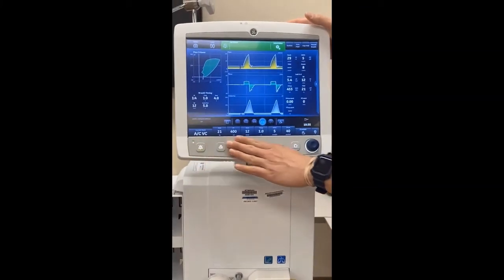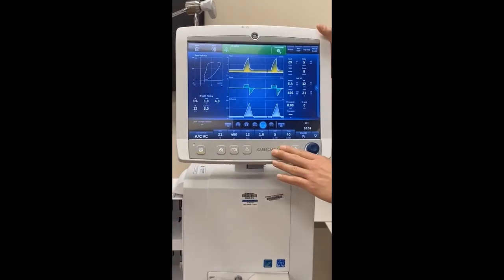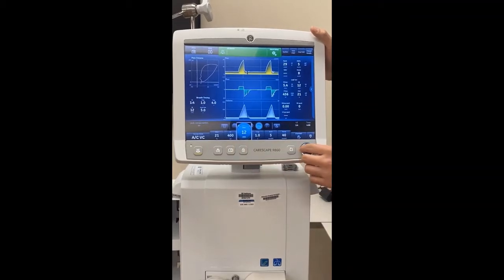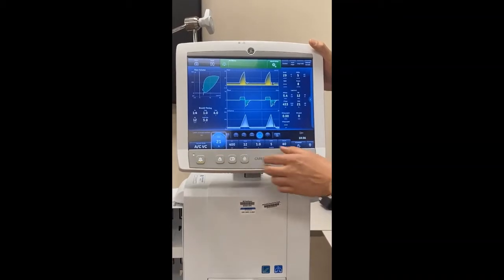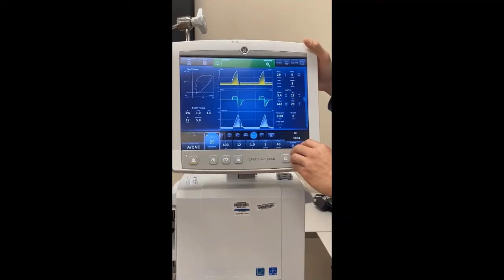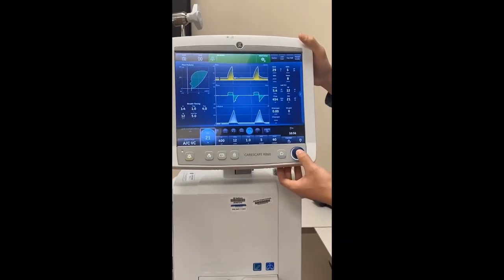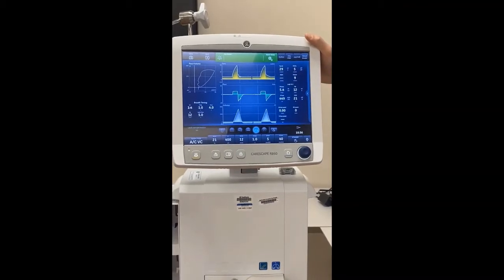These are our set settings by the doctor. We will have these set per doctor's orders, and these are the settings that will get changed per doctor's request. It is touchscreen friendly. We are able to touch the screen and move with the knob here to accommodate those changes that the doctor requests. How we accept, you can do two ways. You can press the touchscreen, or you can accept it by pressing the knob here, which would then accept the settings that you desire.